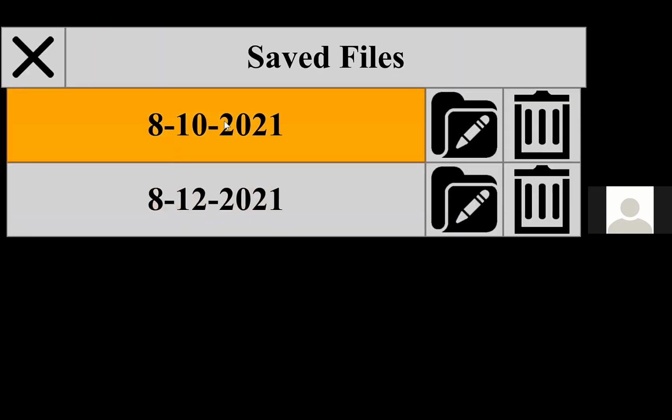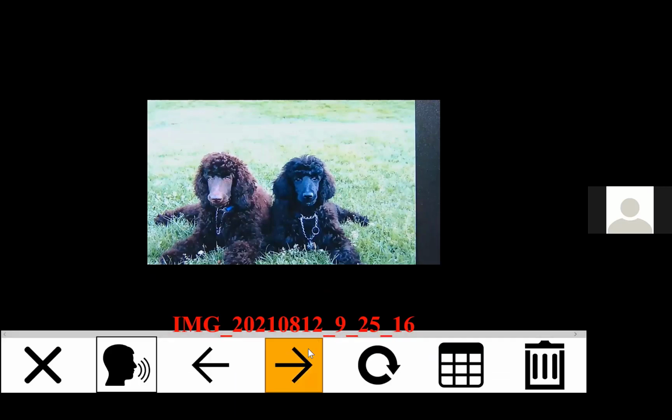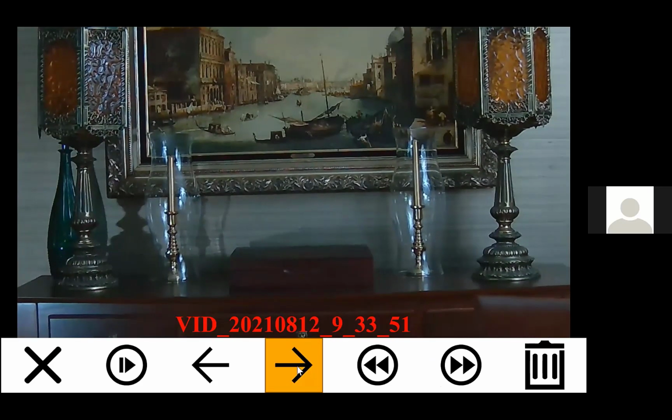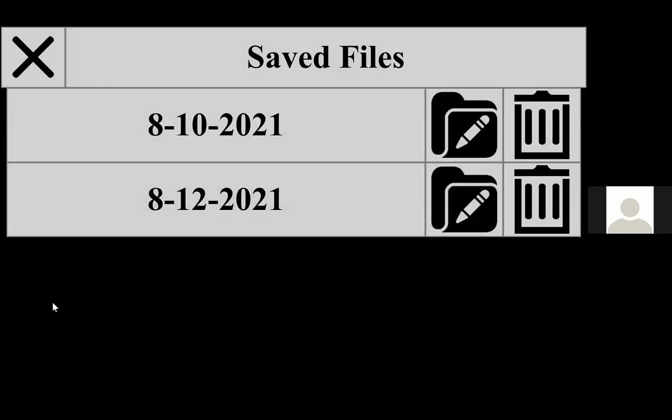And so you'll notice I have some files from the 10th, so 2 days ago, and then I have today's date, the 12th. And when I click on that, I have my image that I saved earlier. And now down the bottom, you'll notice that the toolbar has changed, and I can actually swipe through. I don't want to listen to myself there again. But what that'll do is you can go through and listen to or see what you've saved.